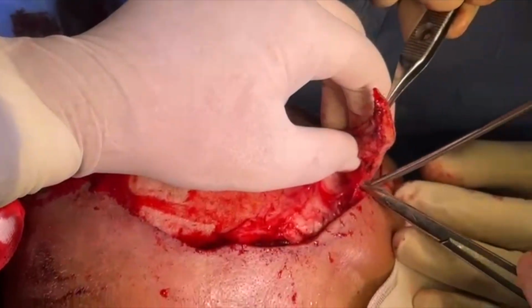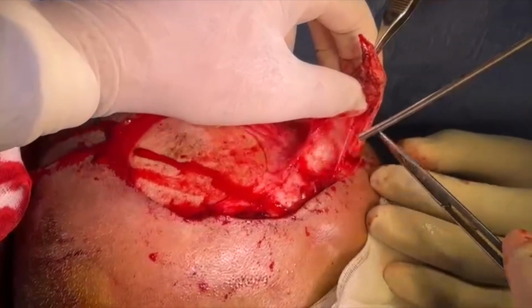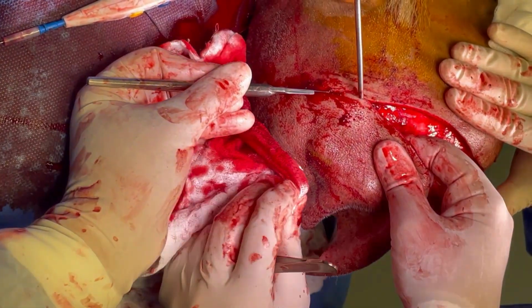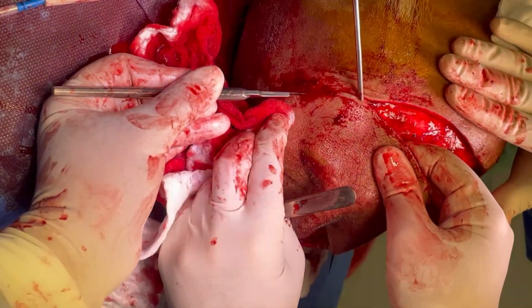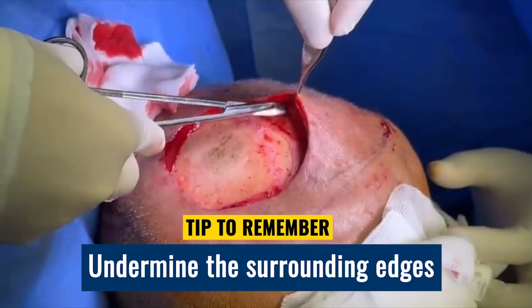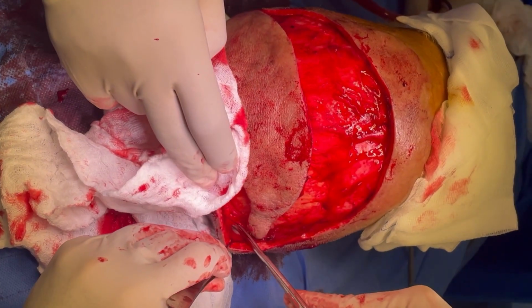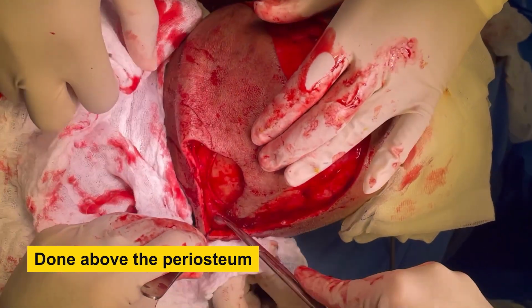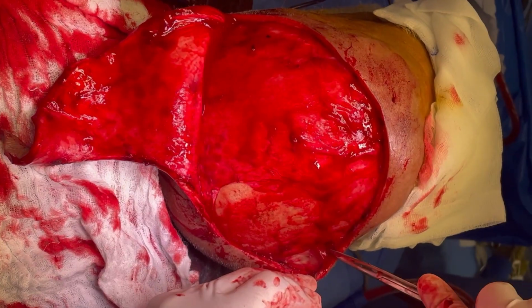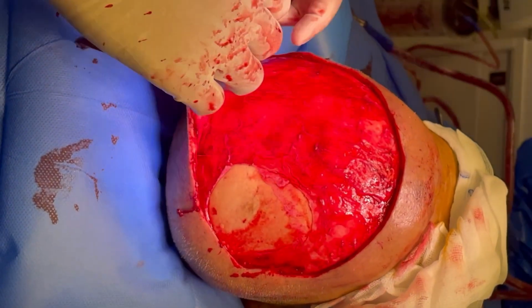We have a plane here where the flap has been raised from the periosteum, from the tumor side, and from the incision margin we are raising the flap. If the defect is not closing properly, undermine the surrounding edges. This is also done just above the periosteum. Flap is now rotated into the defect.